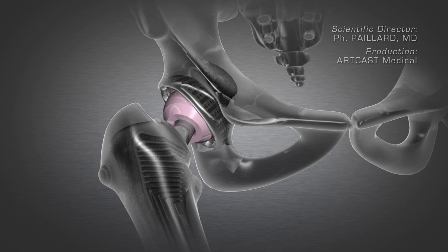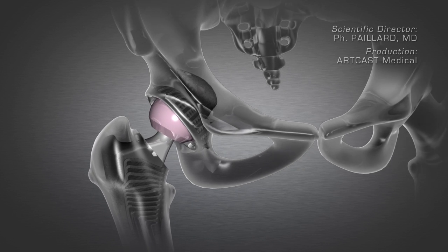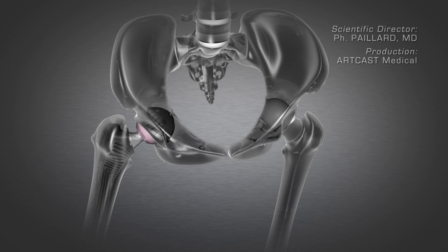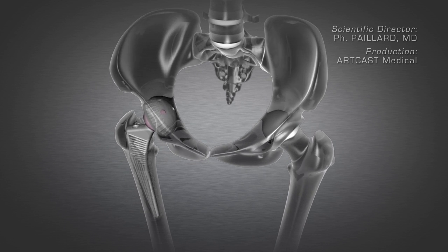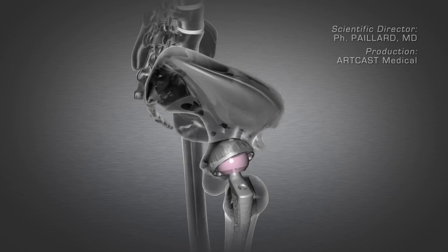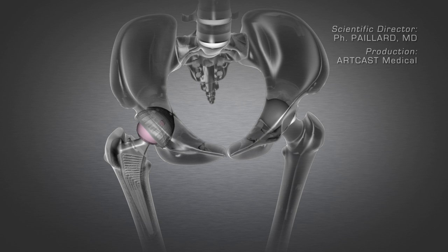The hip recovers full mobility and is no longer painful. Cementless, alumina-based implants are generally used, providing optimal duration of the prosthesis. This replacement is performed using a minimally invasive anterior approach. All the hip muscles are preserved, thus enabling rapid recovery and good stability. An incision can also be made in the groin for aesthetic purposes.